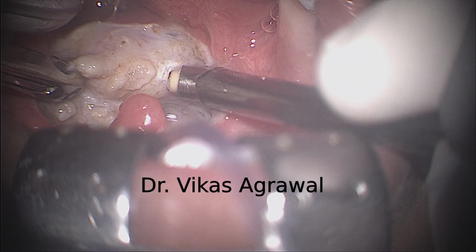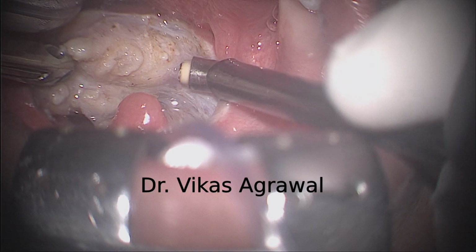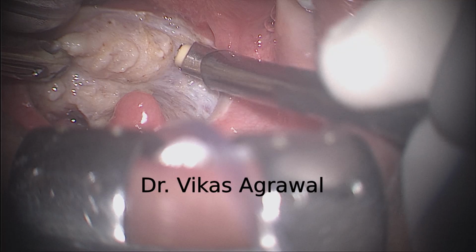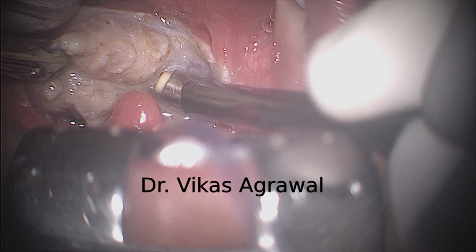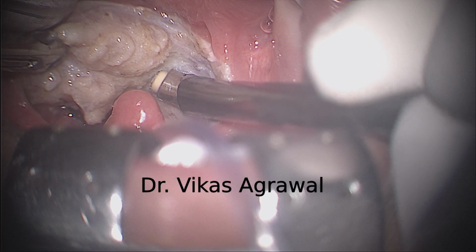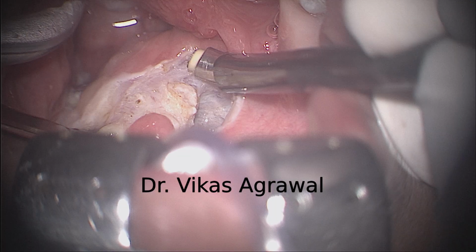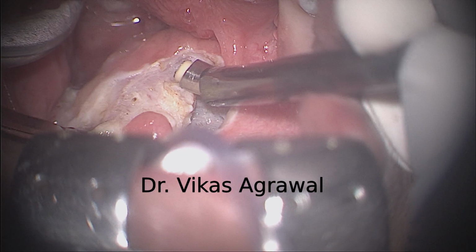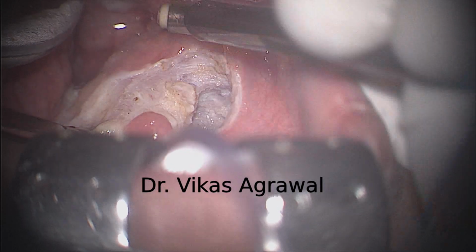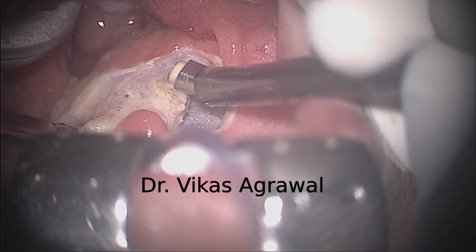Now we are still dissecting very cleanly between the lymphoid tissues and the muscles, only concentrating on dividing the connective tissue fibers. Now we are entering the lower pole. So this whole thing is the lower pole. The lower pole is not here. So we can get the tonsillar artery anywhere in between.